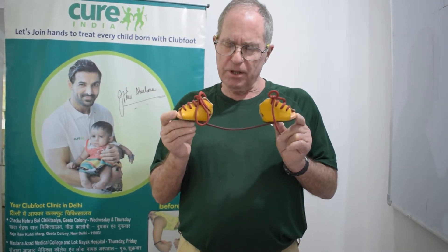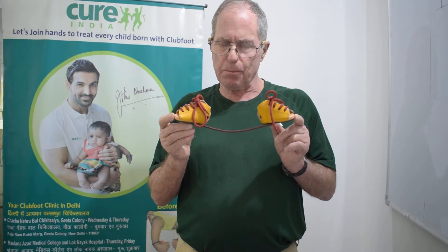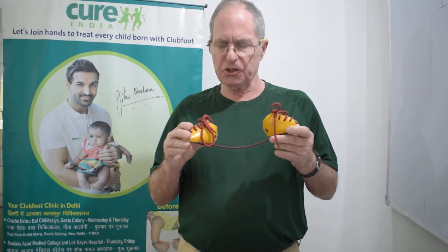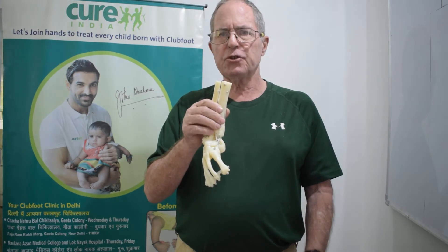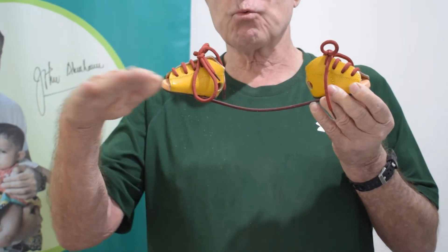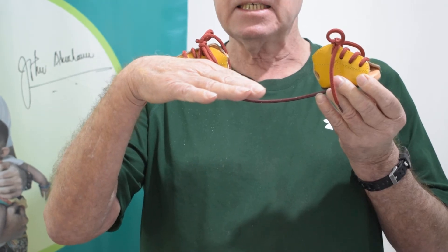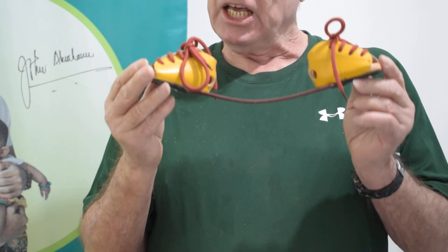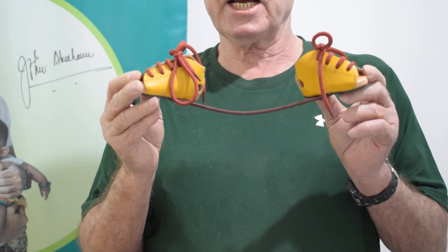The important thing about foot abduction braces is their protective value. It takes weeks and sometimes months to change a deformed foot into a normal foot, but the bracing is designed to preserve that correction. Without bracing, the likelihood of relapse or reversion to an adducted position is frightfully high. Therefore, braces are important to protect the work.